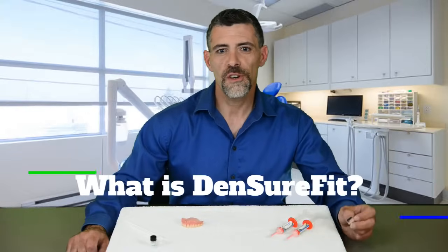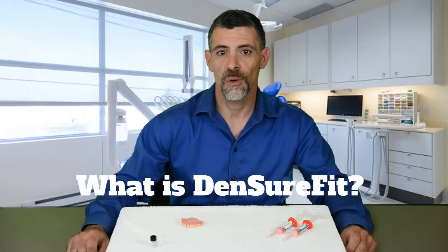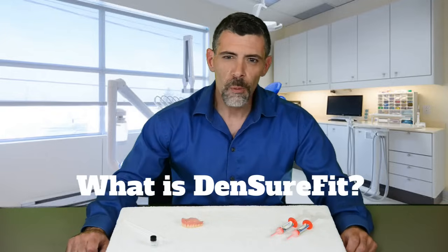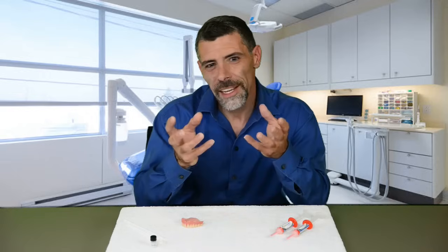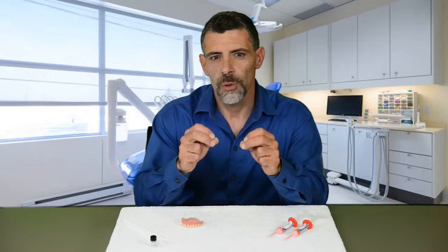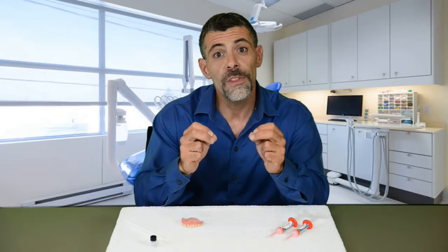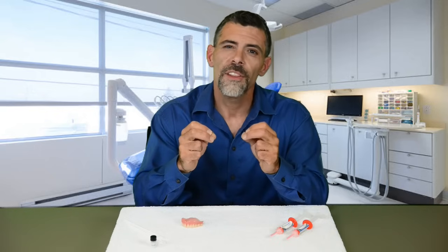Hi and thank you for joining me to learn how to properly line your denture with DenSureFit. Before we get started, I wanted to take a moment to ensure that you understand exactly what DenSureFit is not — DenSureFit is not an adhesive. Quite frankly, it's better. So what is DenSureFit? Well, DenSureFit is a soft silicone dental grade material used to line your denture to improve the fit and comfort of that denture.